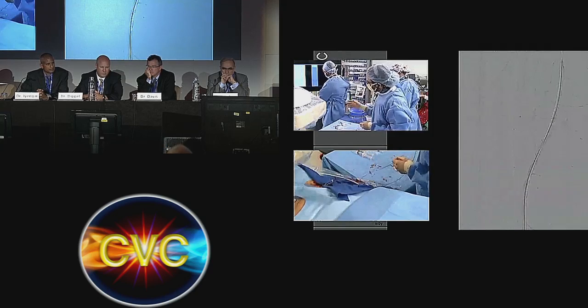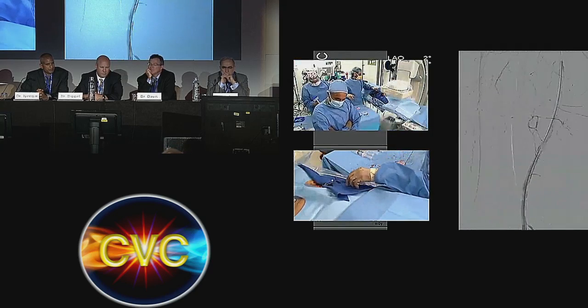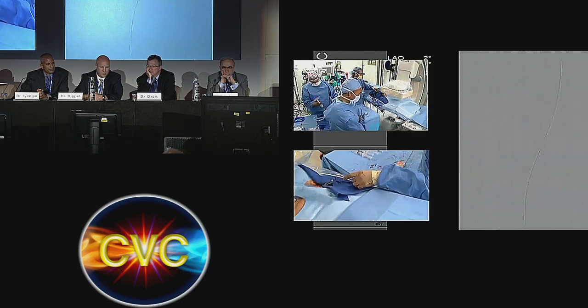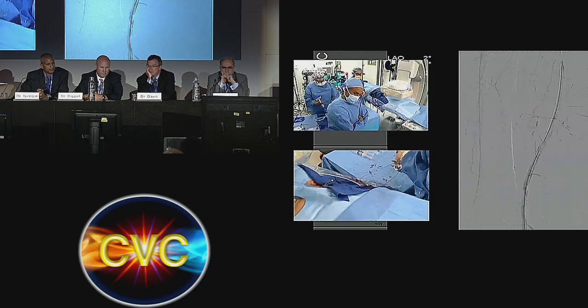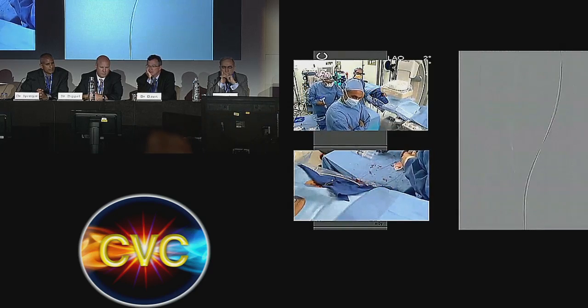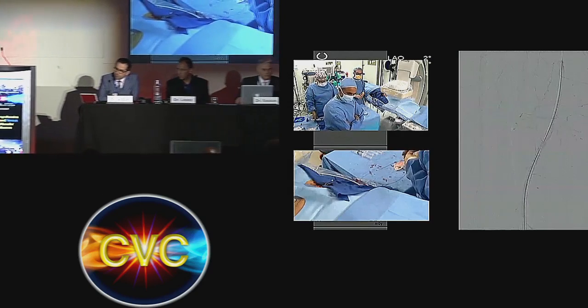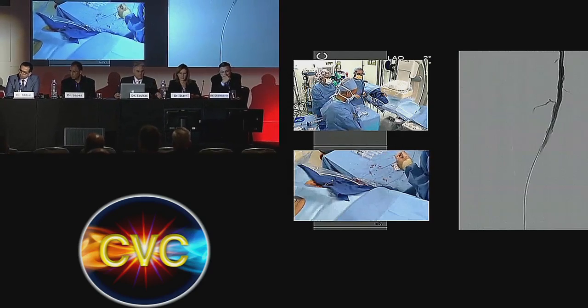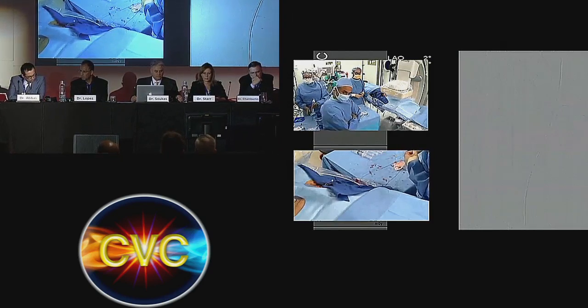So at least what I'm seeing here, I think we would have to add to that comment, Luis, that we actually have a couple of papers from our group, one particularly on the use of mimetic technology, the Supera stent from Abbott, in popliteals, having really good results in pretty bad surgical candidates who have no adequate conduit for distal below-the-knee bypass, and the results have actually been good. So we felt good about that.